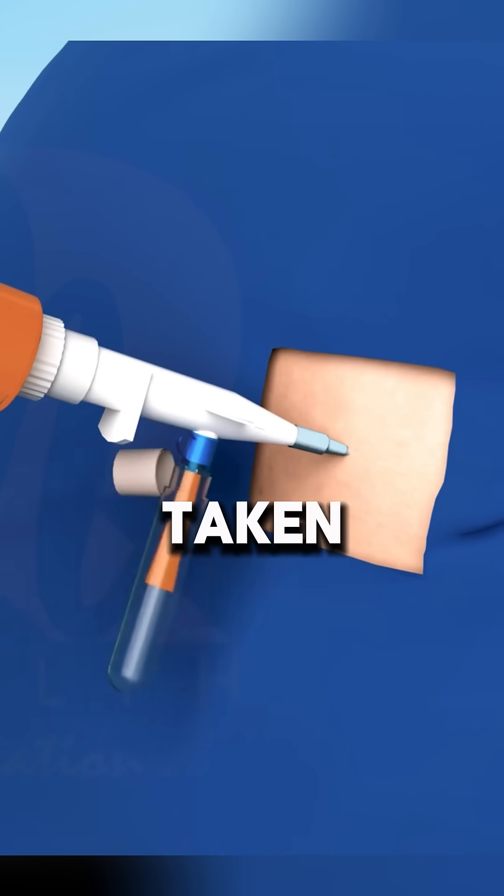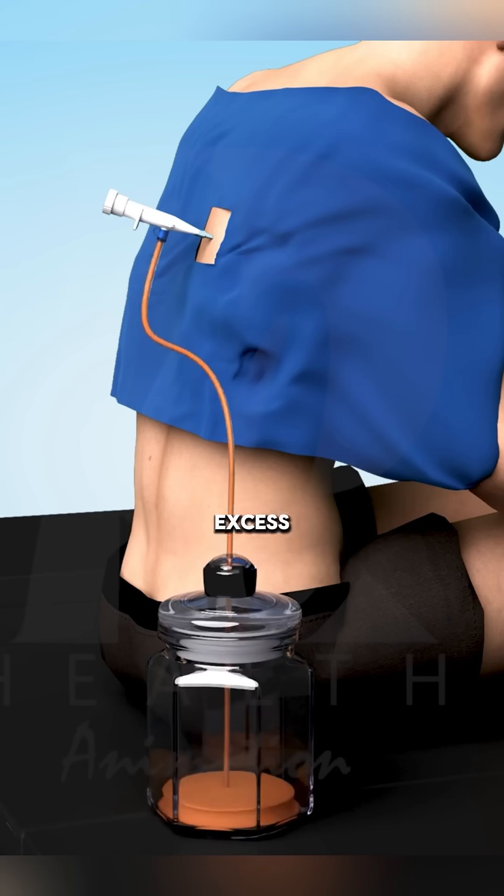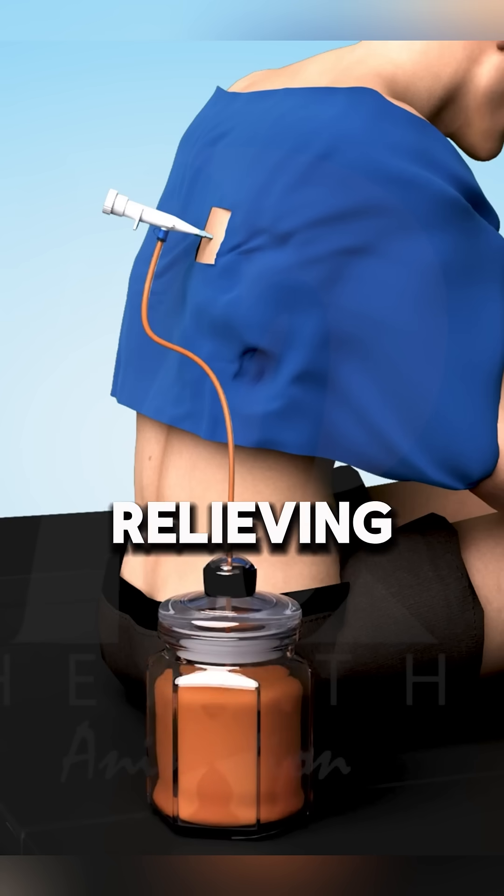Fluid removal: a sample is taken for lab analysis and a bottle is connected to the cannula to safely drain the excess fluid, gradually relieving lung pressure.